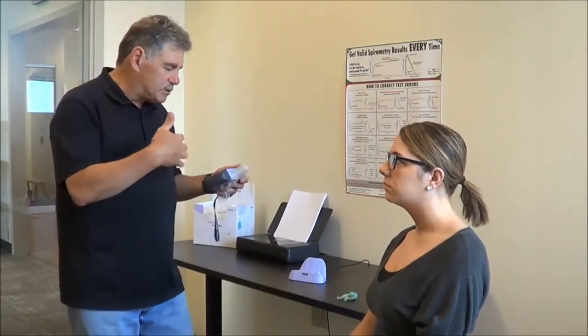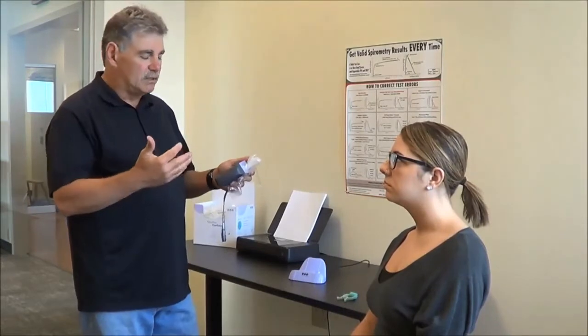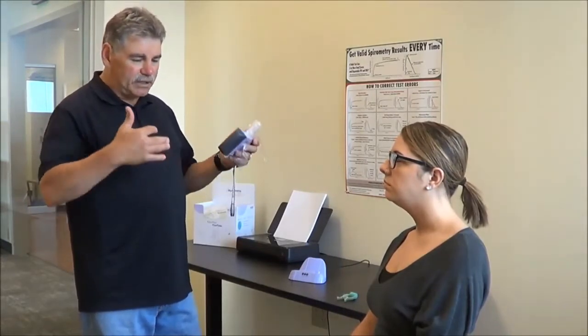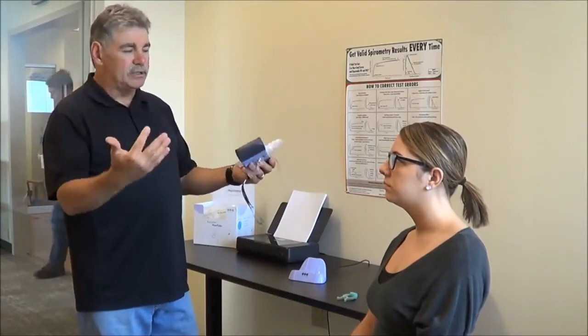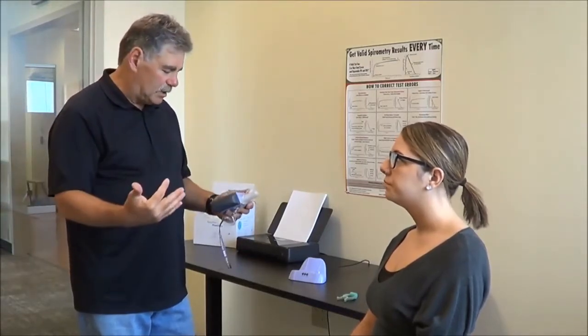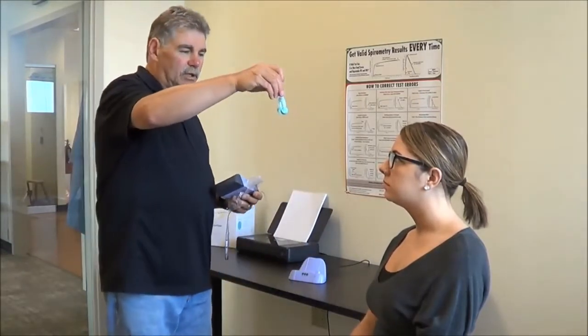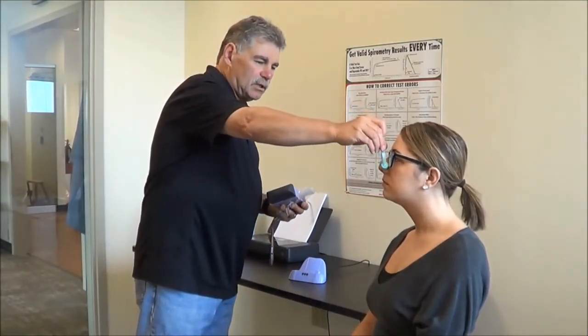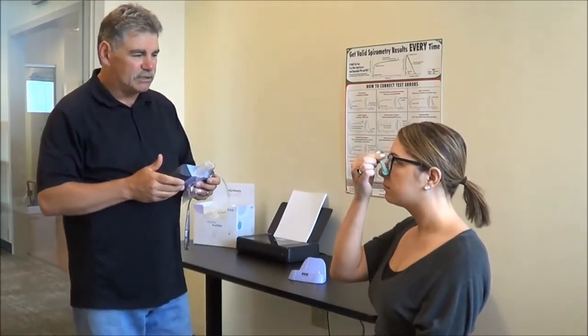At this point, I would instruct the patient to make sure that the patient understands these three steps of filling lungs, blasting out, and continuing to go until all the air is gone. We also want to use a nose clip to make sure that while Tina's blowing, she does not lose any air through the nose. Make sure that's comfortable on there.